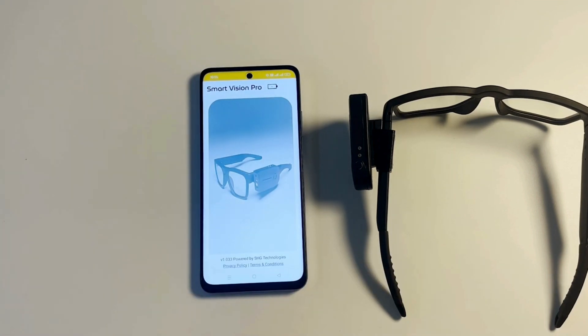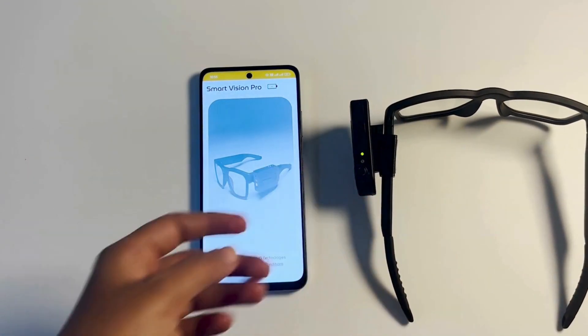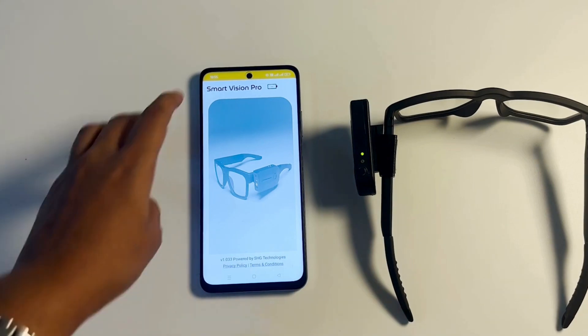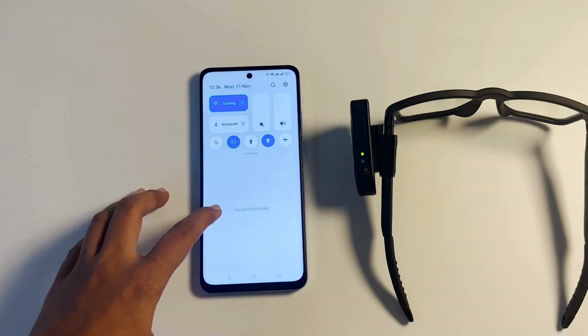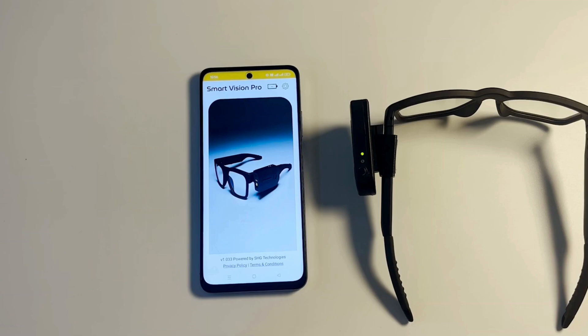Please turn on your SVG device. Turn on your Wi-Fi. Smart Vision Glasses connected successfully.